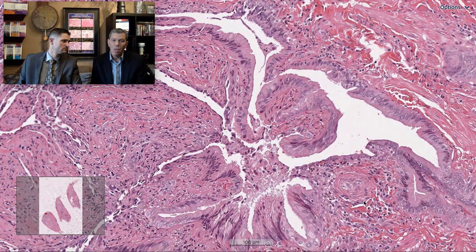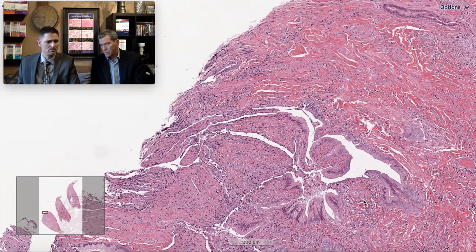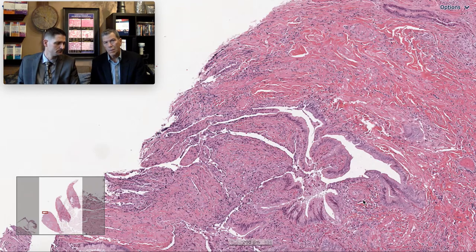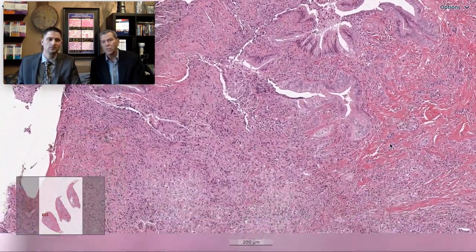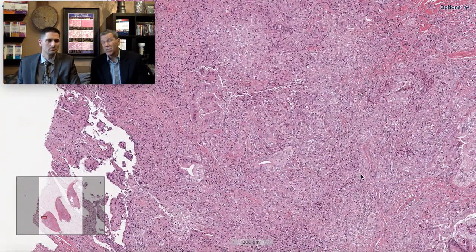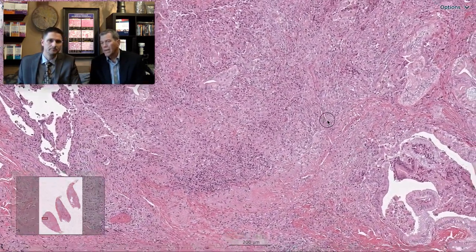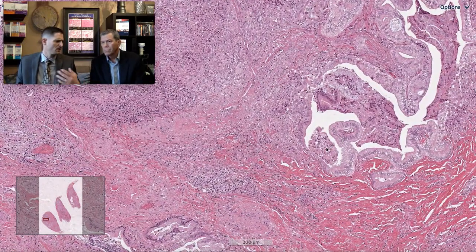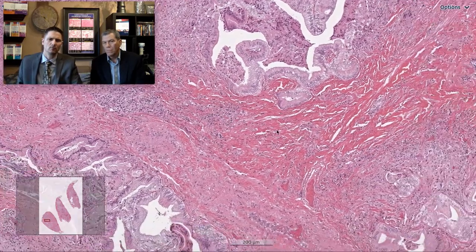What could give you infiltrates? We have to look for infection features — necrosis, granulomas, neutrophils. We need to look for acute exacerbation, which might be organizing pneumonia separate from or adjacent to scar, or DAD with hyaline membranes near scar. Also, some patients with fibrotic lung disease seem to be at higher risk for cancer — because of scarring, inflammation, and high cellular turnover, similar to the liver model and the asbestos/mesothelioma model.